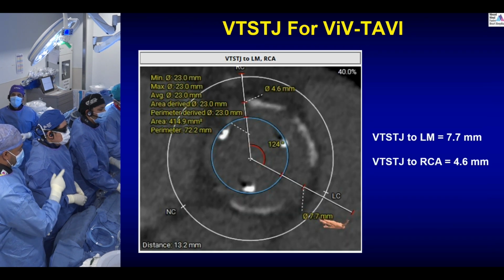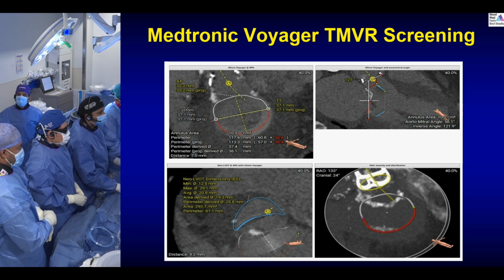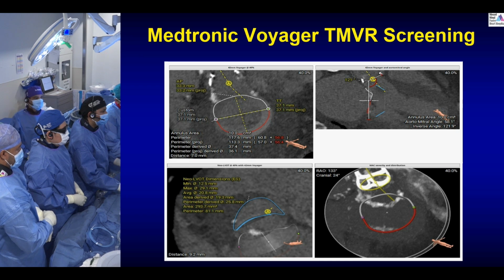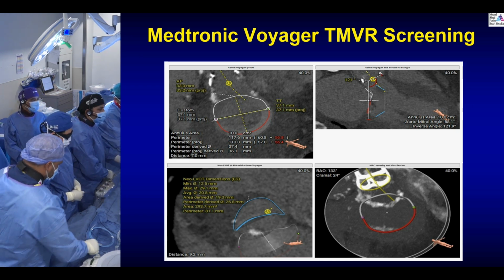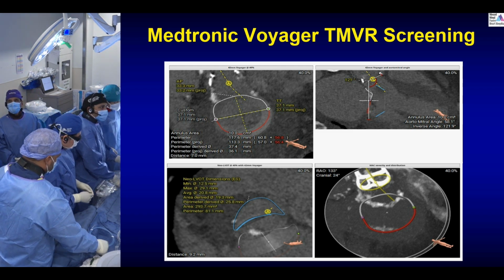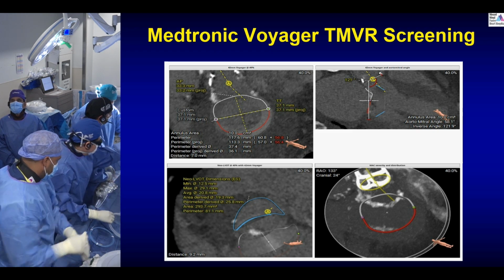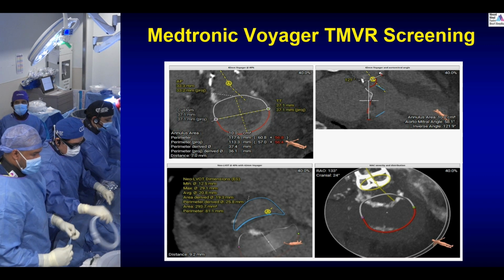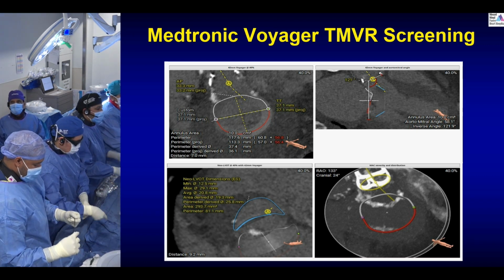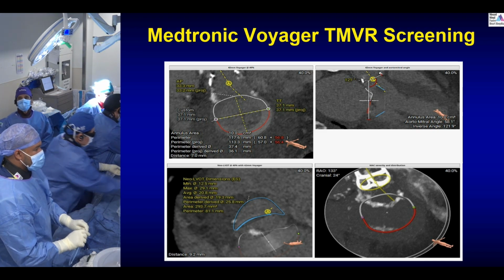Okay, so let's go to our next slide. I will finish up the slides quickly. I just want to bring up the point. This patient presented with moderate severe MAC. The prosthetic aortic valve degeneration was actually more like a secondary finding. So you can see we actually screened the patient for the Medtronic Voyager valve. This is a new 29 French system for the Apollo trial. And you can see that the neo LVOT is wide open, almost 300 millimeter square. She's already approved for the 42 millimeter device. So we're going to bring her back 90 days after today's intervention for the trial. I just want to show you that she will be a candidate. Maybe we can show that in the future.